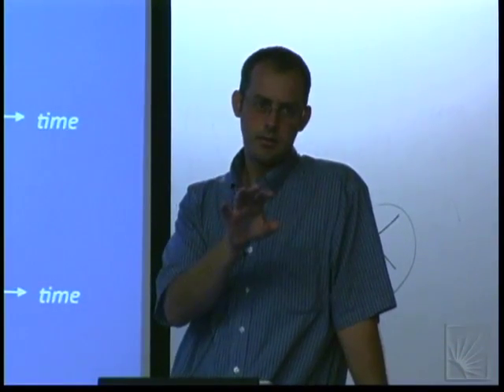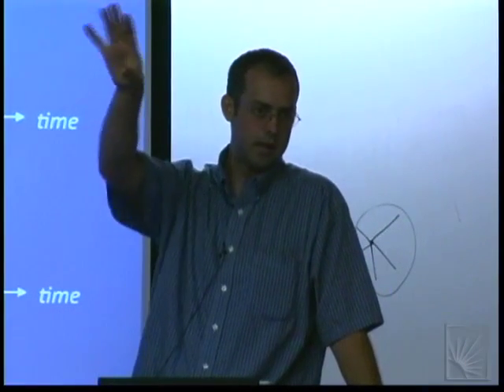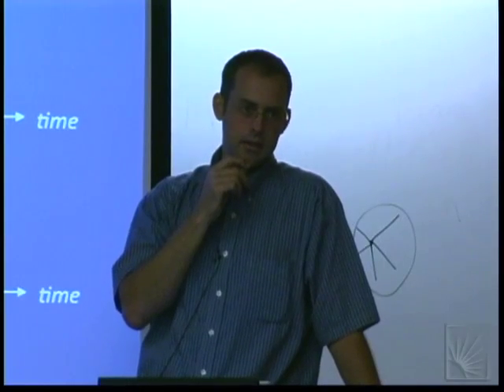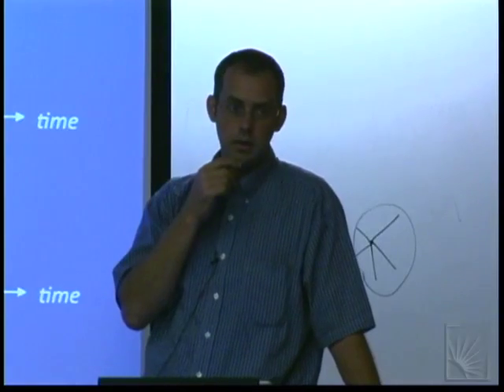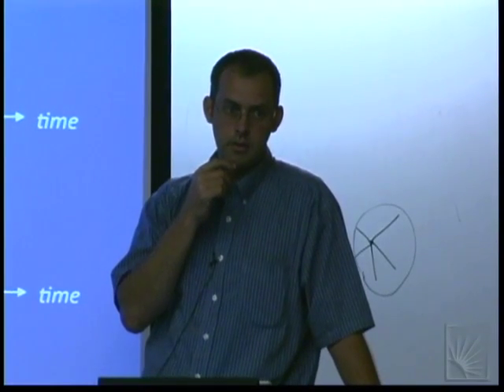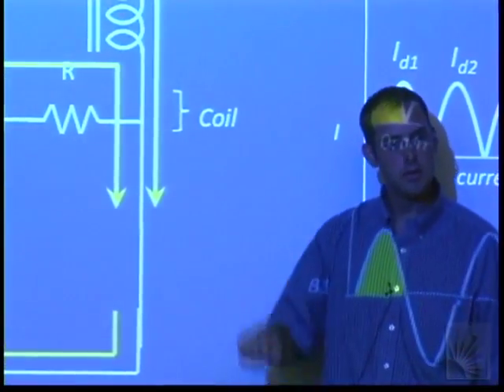There's an RF screen. These are in the megahertz range. There's a copper cylinder on the inside of the magnet which prevents any of the RF energy from getting into that supercon. And the ESR of those inductors, the effective series resistance, is small enough that you're not really burning up power. The ESR of these inductors and the on resistance are the two dominant sources of power dissipation in the amp, but they're both on the same order as what we're dissipating in the patient.